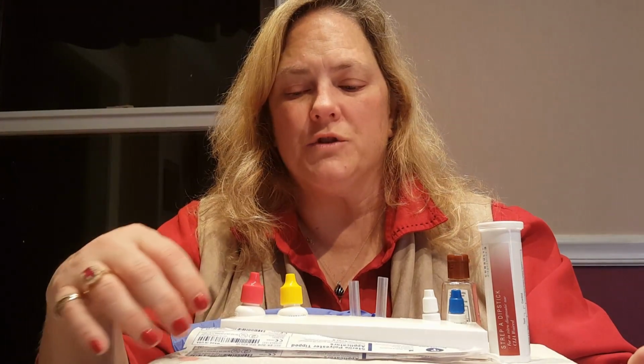And again, as with all CLIA-waived testing or any patient interactions, we want to be sure that we're verifying two forms of patient identification when we enter the room and before we do any invasive testing. That can be the name and date of birth or the patient's last four of their social, as per Wheeler Clinic policy. So when you go in the room, you really only need to bring the swab and a patient label, which the patient should verify is correct information, so that you can label the specimen when you take it out of the room.